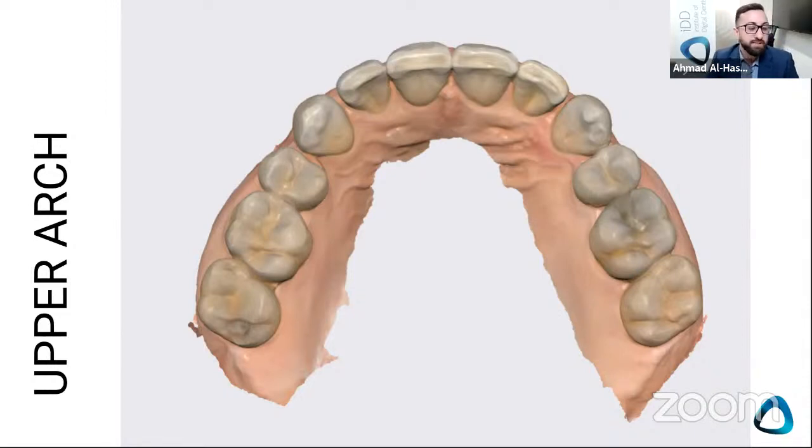Someone says premolars, occlusal of the molar, occlusal. Thanks, Veronica. Thanks, Khalid. Distal of the molars. Now, does anyone know why we start on the occlusal area? Everyone kind of says occlusal. So yes, we start on the occlusal. That's perfect. That's really important to know, guys.